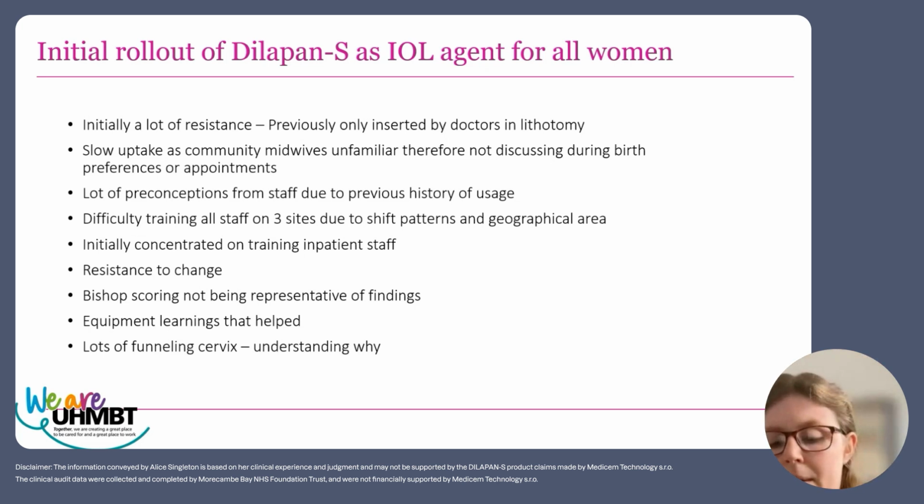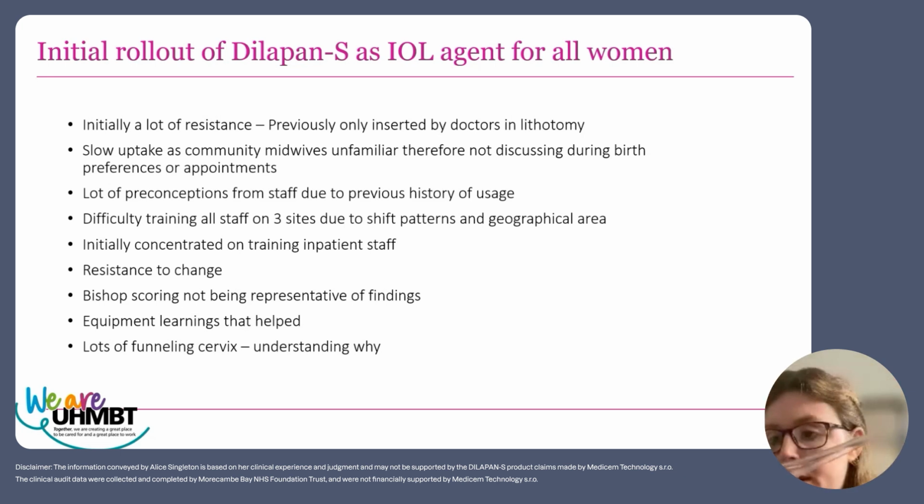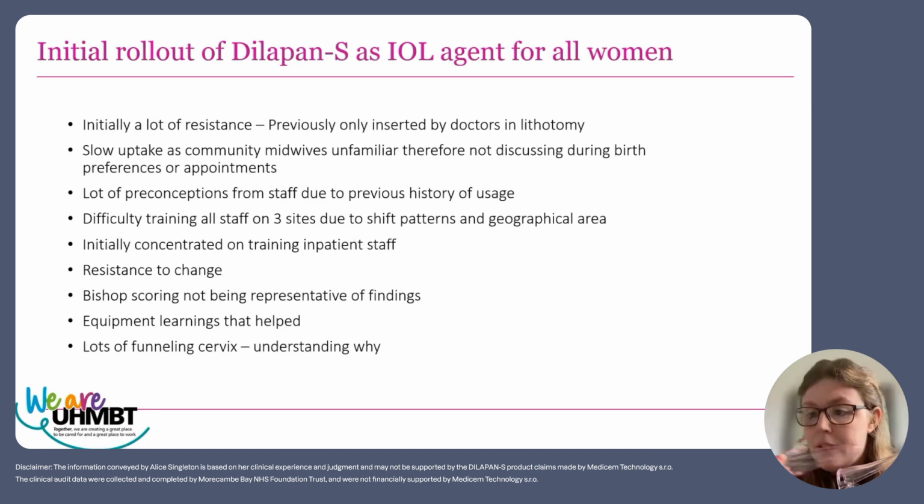For those of you that get a lot of grand multips or ladies with poor elasticity of the vaginal walls, this was another good one that we came across. It's a speculum that you put in that's normal, you lock it like so, and then you have a little insert that goes inside the cervix like that, and then it opens out. Can you just about see that? I always explain it's like a petal, so it opens up and holds the vaginal walls out of the way. Okay.